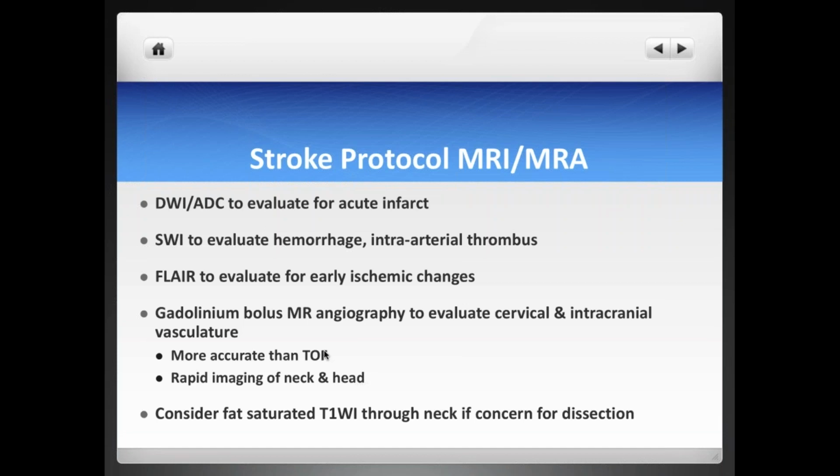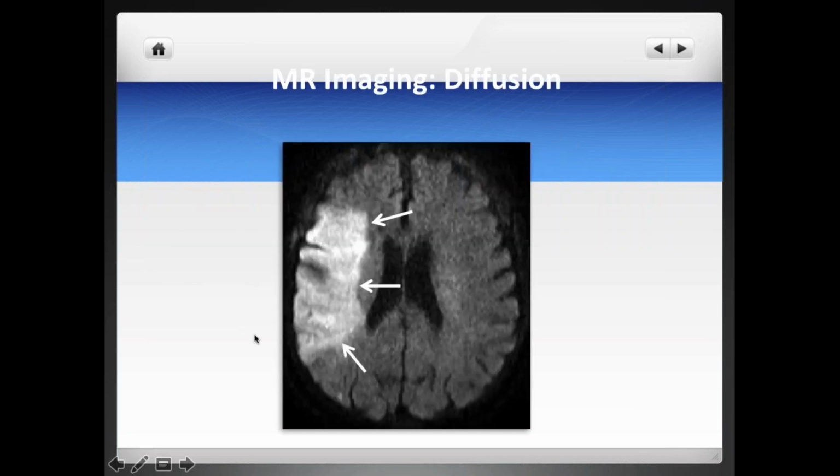The downside of MRI, of course, is the time it takes to get a sequence, probably about 4 to 5 minutes per sequence, not to take into account the fact that it usually takes time to get the checklist for MRI, to be able to scan the patient in the MRI scanner, and of course getting MRI availability 24/7, which some centers don't have. Even if you do, taking the patient to the MRI scanner is a little bit more of a hassle than doing it for CT. But we limit it, as I said, typically to when we do need it in some situations, and I'll give a few examples later. We will use very specific sequences.